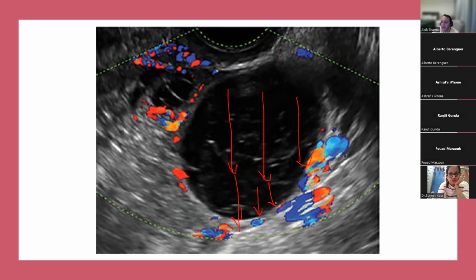It's not as bright over here. It's even less bright over here because the sound waves traveling directly will have more energy. But for sound waves traveling in this direction, they're going to have to pass through more tissue. They will interact with this, they will refract, they'll get absorbed. And this is basically what is producing what is called a sea sign over here.